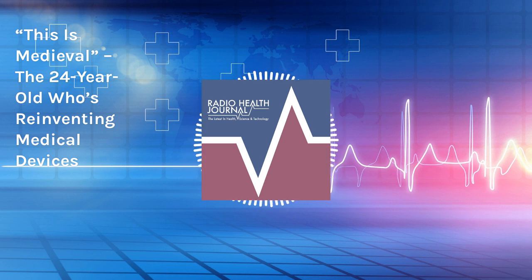And then when the motor shuts off automatically, because the drill bit is conical shaped, you can't push any further. So it prevents accidental plunge into the brain via both that software and that additional hardware mechanism. Plunging is when a device drills past the skull and down into the soft tissue of the brain. Potts says that it happens very rarely.